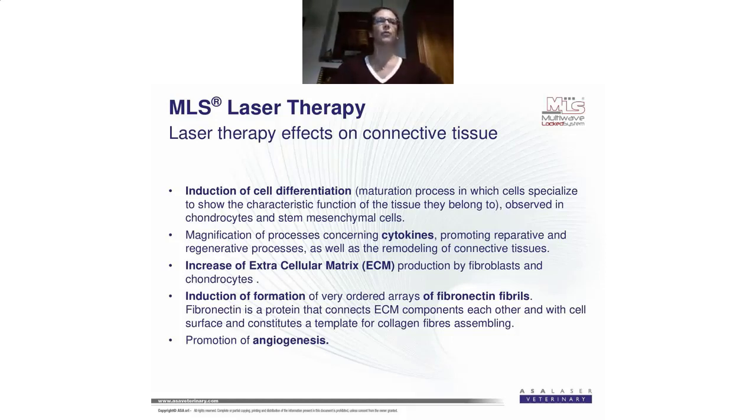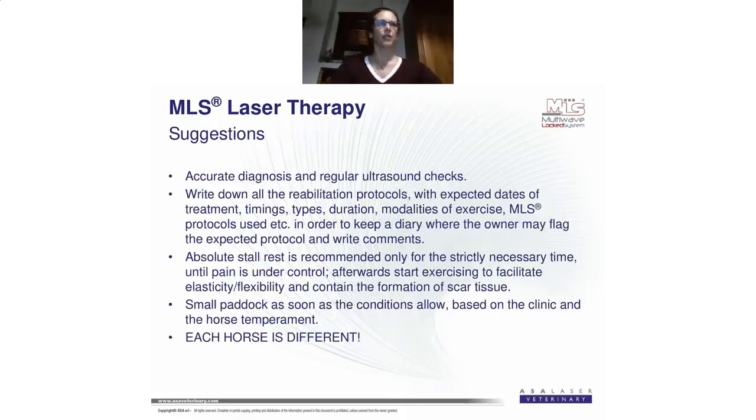And we have the promotion of angiogenesis, which is very important in these structures where the blood supply is very low.